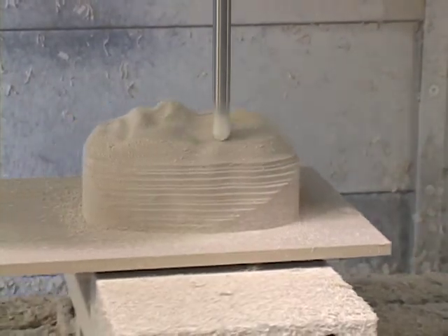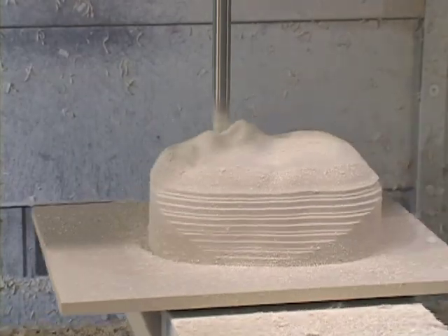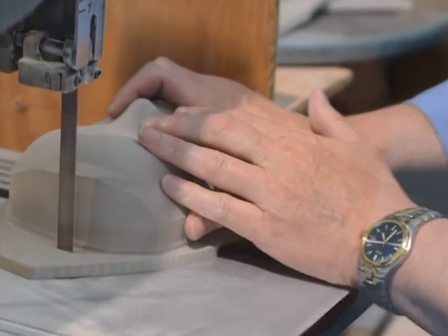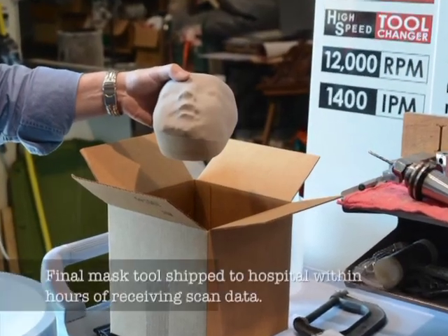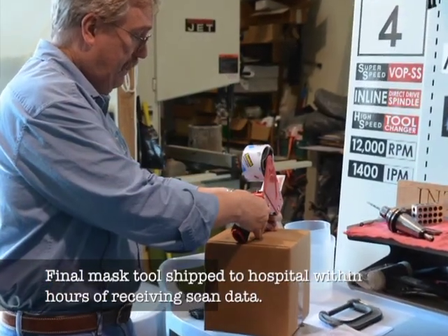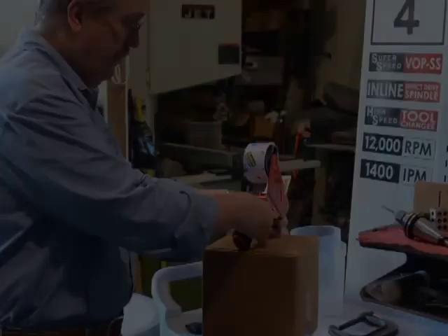We can do all that on the computer, so that when we make the mask — the positive tool — and then make the mask on that, the mask is almost exactly what I want to fit to the patient right away.